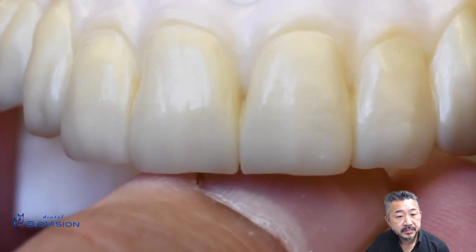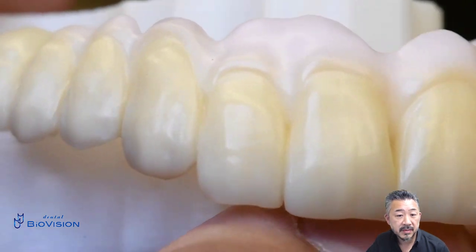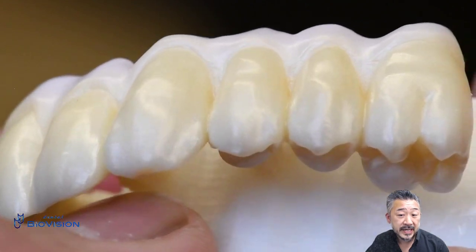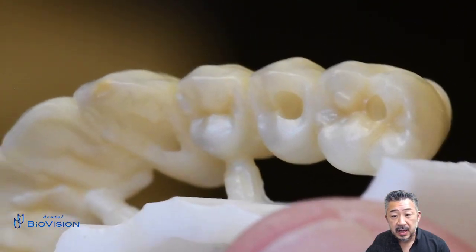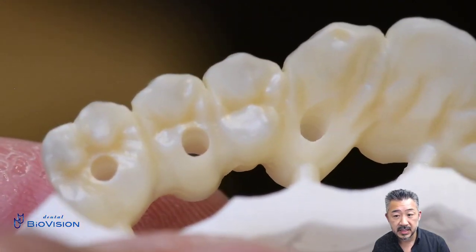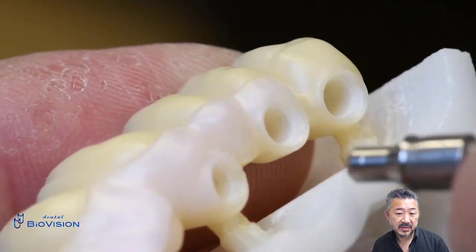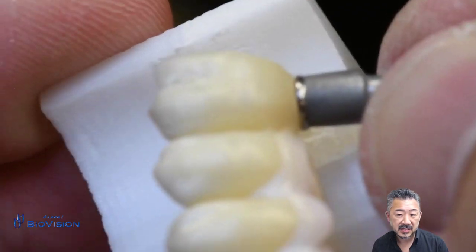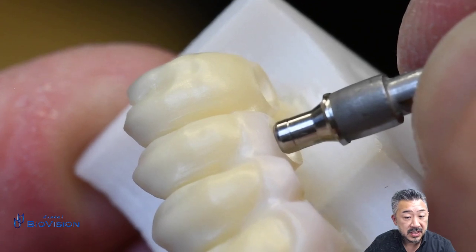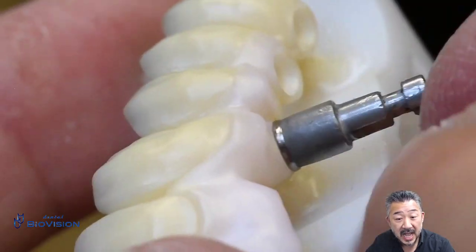After sintering, the crown now has gradation of color from cervix to incisal edge, although the overall coloring is light. My suggestion is that the coloring is controlled by staining after this. You can also see the fit of the joints of each titanium ring in this video — a nice fit without any adjustment. All parts are unadjusted.